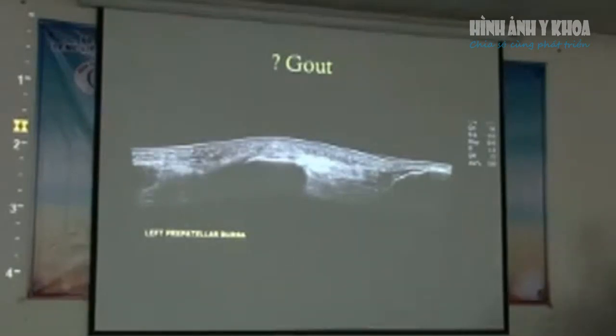So he was presented to us for an injection into the prepatellar bursa just for symptom control.